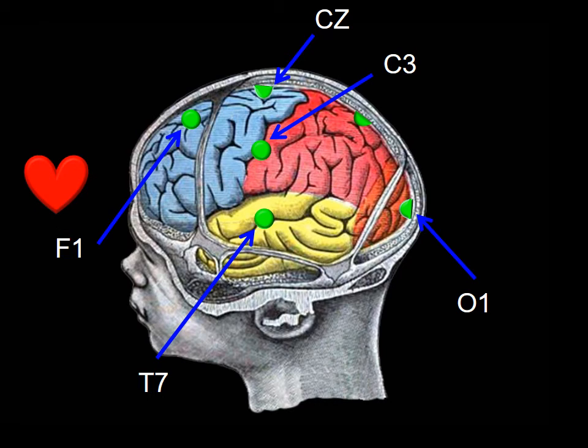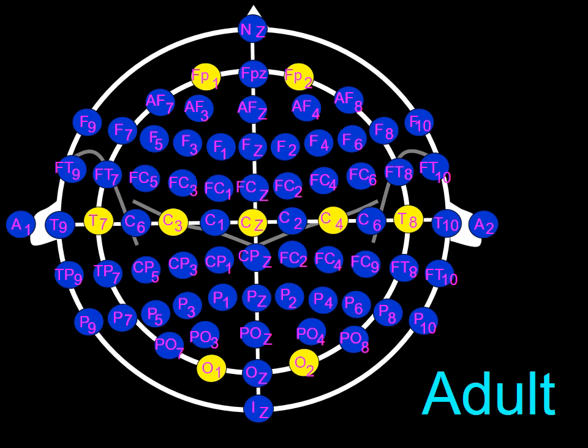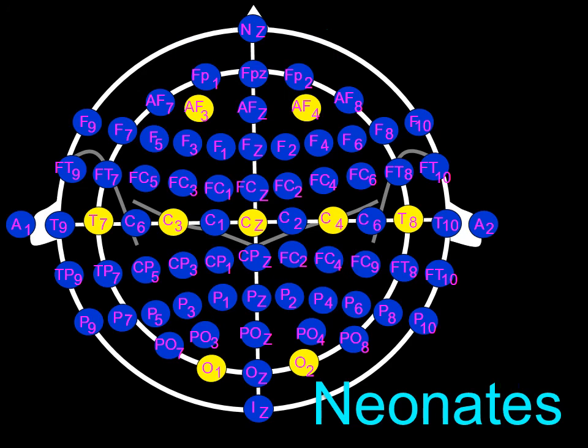One good thing about placing the electrode so close to the midline is that the EKG artifact from F1 is tolerable. I will now address the second alternative. This alternative is to move FP1 and FP2 just a little backwards to the left anterior frontal electrode and the right anterior frontal electrode.